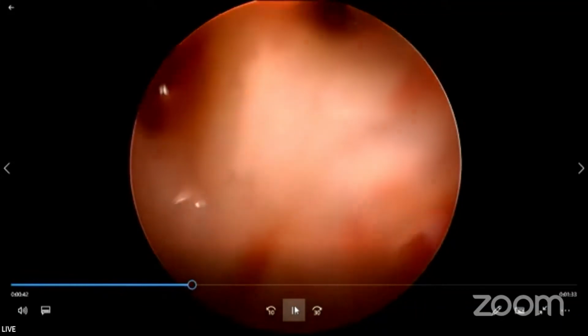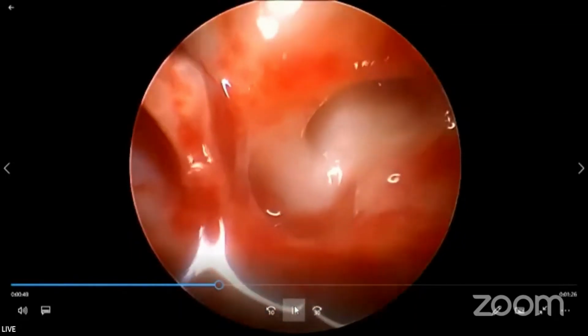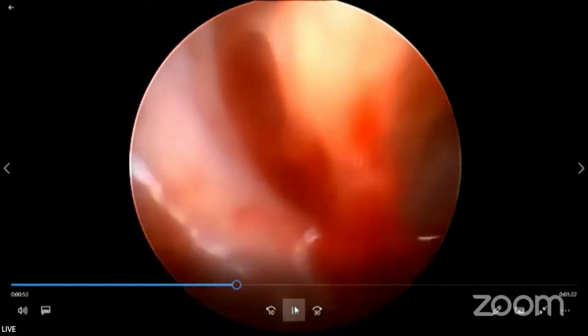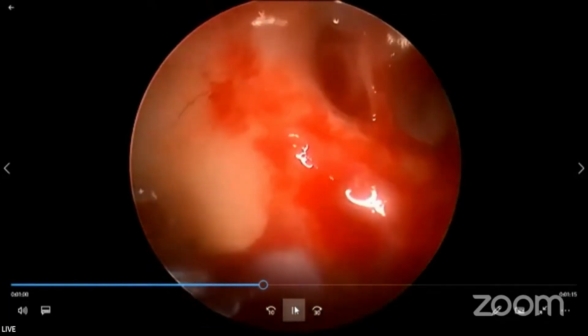The full structure itself. So whenever it comes very much close to the blood, rather than removing the endoscope out, you can just irrigate the cavity so that the parts of the endoscope get clear.